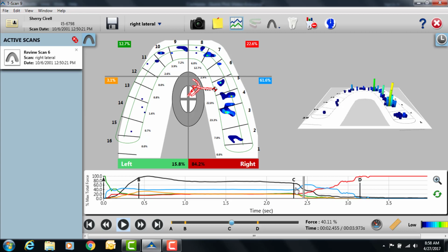It actually increases. You can see the line go up, flatten, and then start to go down slowly. This implies that there's some posterior interference, and that is probably directly related to this red line. Instead of going smoothly to 6, it flattens out. This flat posterior movement can imply group function.